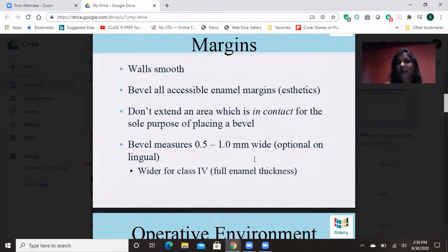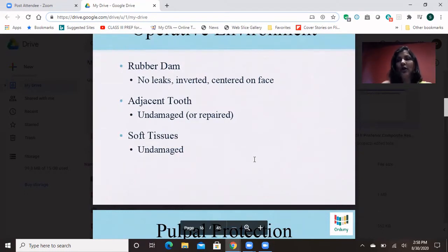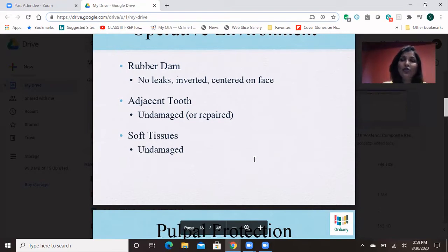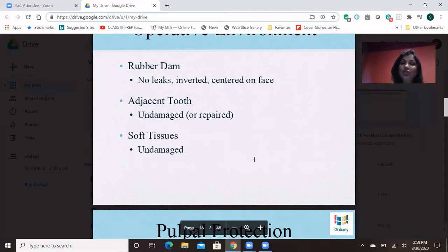Before you start a Class 3 or Class 4 cavity, you do rubber dam — make sure there are no leaks, it's inverted, it's centered on the face, and it's properly placed. When you are doing the prep, you don't want to damage the adjacent tooth, and when you're filling you don't want to damage the adjacent tooth. You have to be very careful with the adjacent tooth — that is a reason the hatchet is a great idea to use for prep. That little ledge which we have left, you remove with the hatchet, and there is no chance it would damage the adjacent tooth. The soft tissues, the gingiva, also have to be protected.